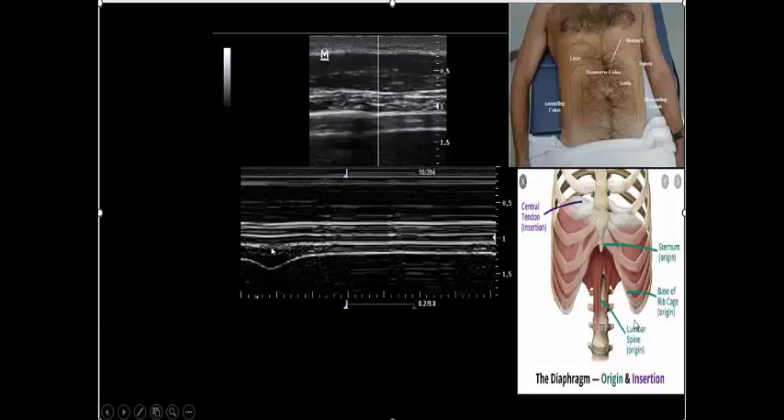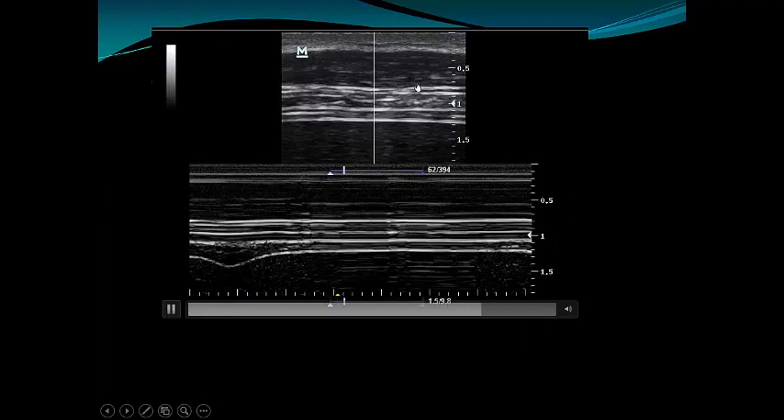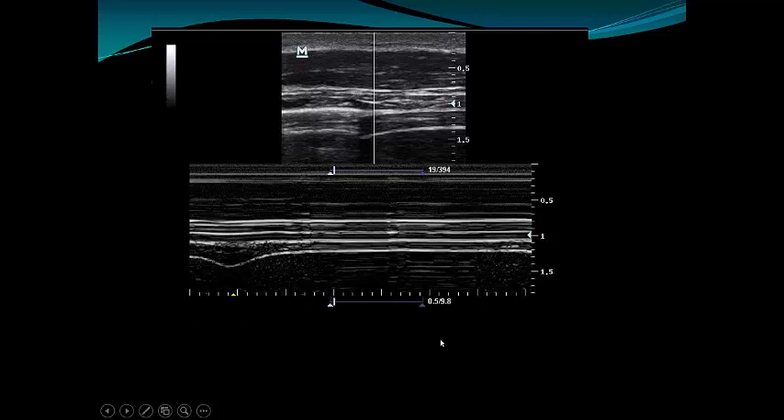Let us see — here our patient is breathing. I place the M-mode cursor 0.5 to 2 centimeters between the liver below and the lung above. The liver is homogeneous and dark here, and the lung is above with a line visible. This is the lung, this is the liver, this is the junction. The M-mode cursor is placed at this junction and determines the degree of thickening. In our patient, the thickness during exhalation is almost 2 millimeters and during inspiration almost 5 millimeters — that means the thickening fraction is almost 100%, which is great.